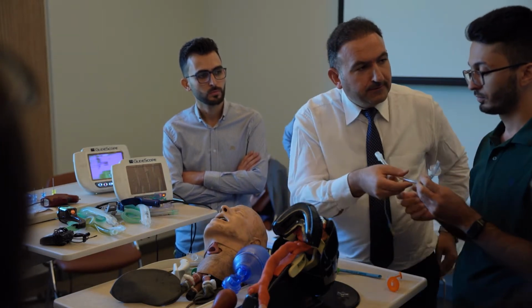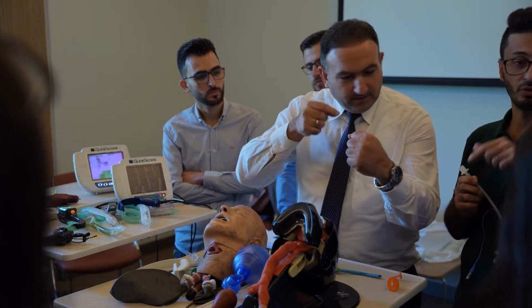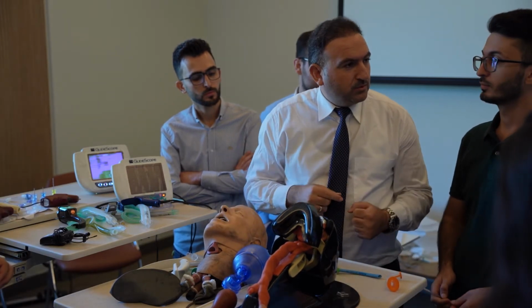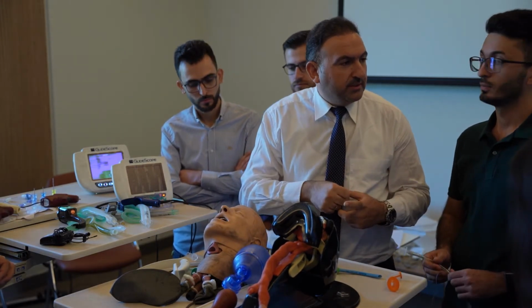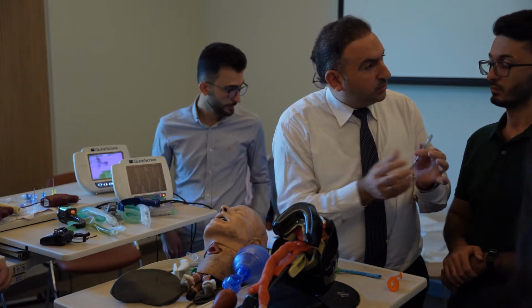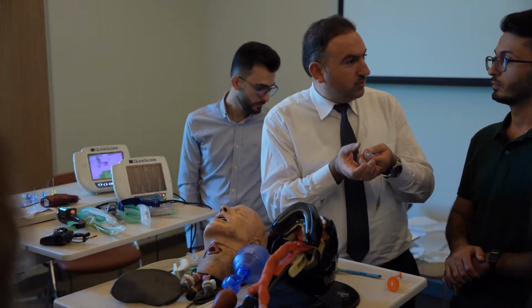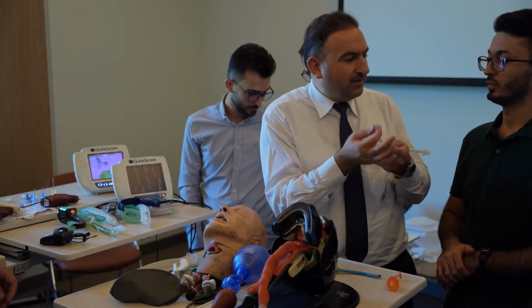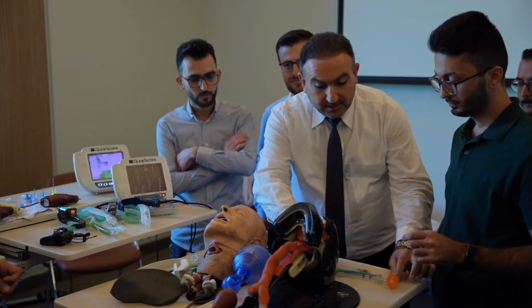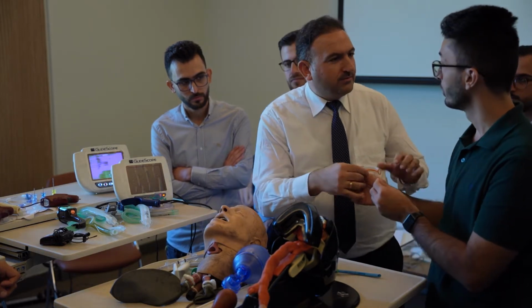What about the length that we have to put inside the larynx? You should decide, because you are the one who holds the tube. Whenever you go beyond the vocal cords, it's about 1 to 2 cm, then it's enough. The cuff should go beyond the vocal cords. It should not stay between the vocal cords when you inflate it, because it will damage them. So about the size, how do we know this is the proper size? I think we checked everything. Yes.